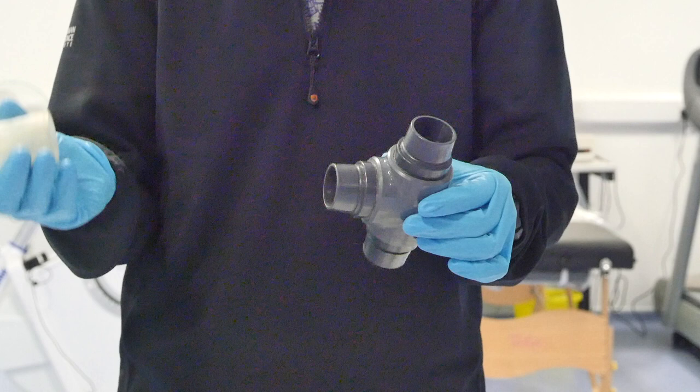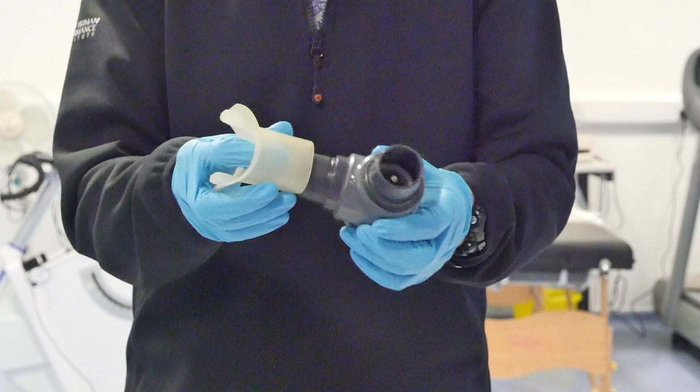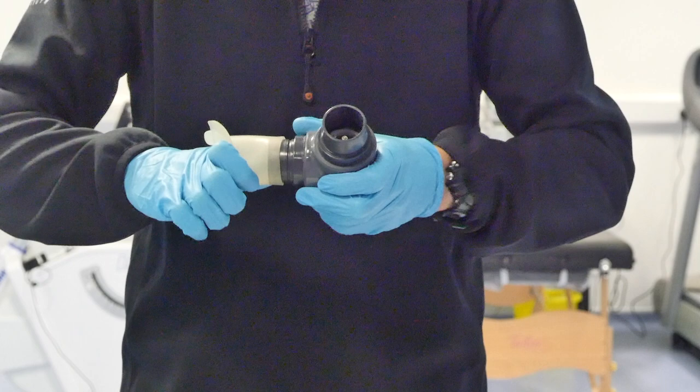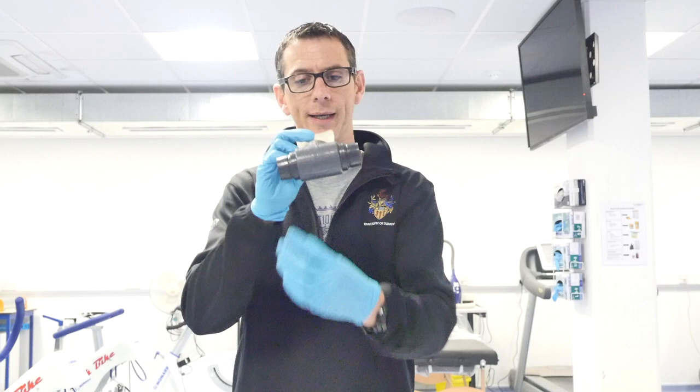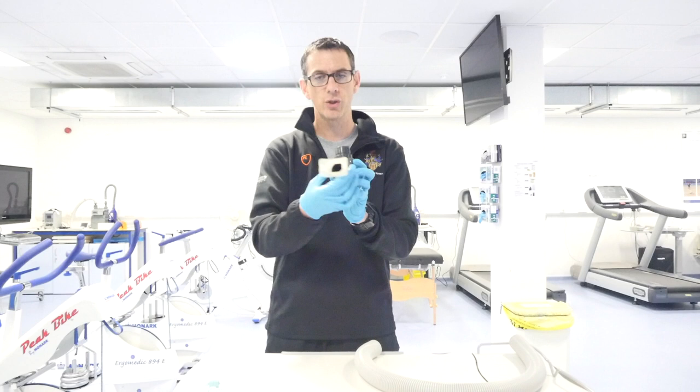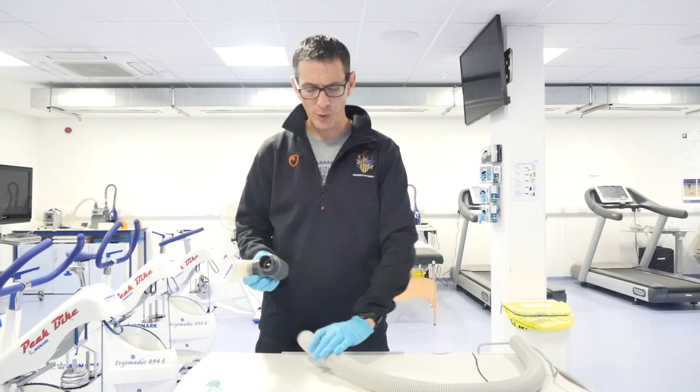The most important part is the two-way valve system. The first thing to do is to fit the mouthpiece onto the system. It's key to know that the mouthpiece is always going to go in the middle of the two-way valve. When you fit it on, I'd always recommend putting it on so the weight of the two-way valve is going down. Some people put it on sideways, but then the weight causes it to drop a little bit. I'd always recommend putting it on straight so it goes straight into the mouth.